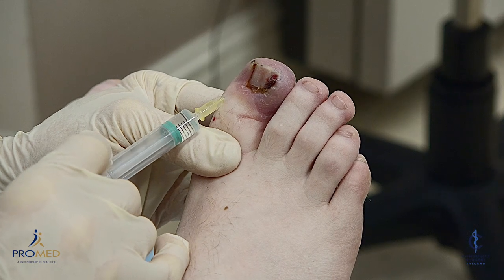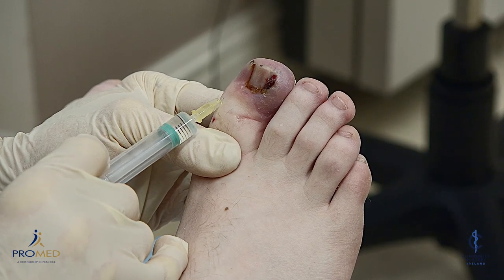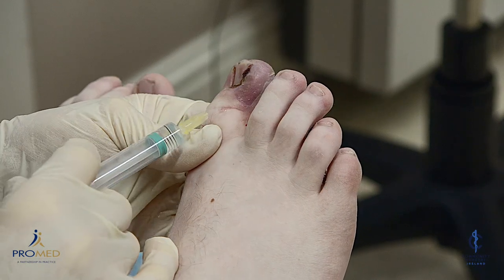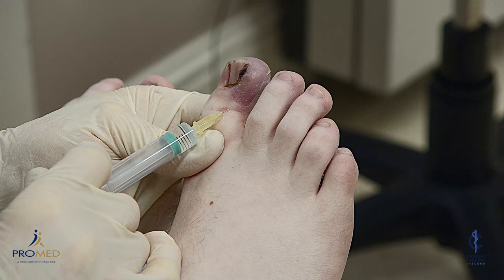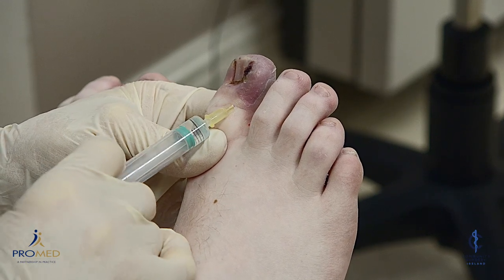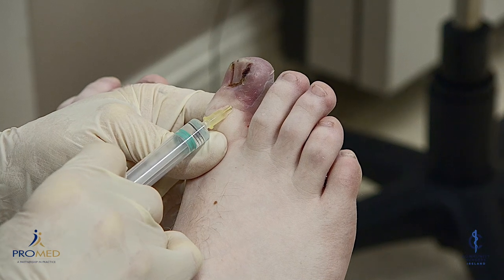Just infiltrating locally as well as doing the ring block. This will take five to ten minutes to work — you have to wait and be patient. A little bit of local infiltration, especially into this side where all the excess granulation tissue is.